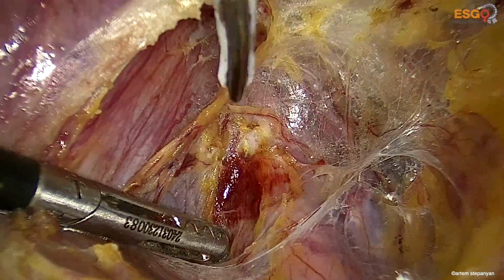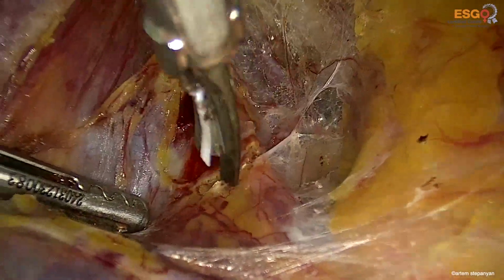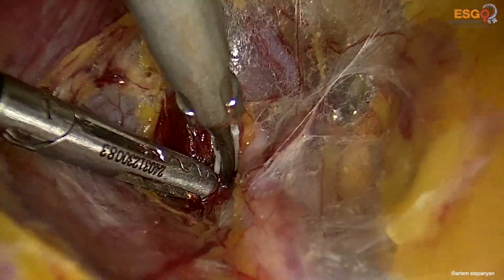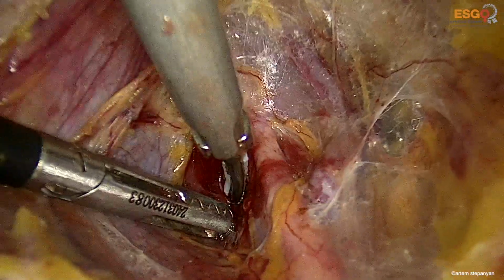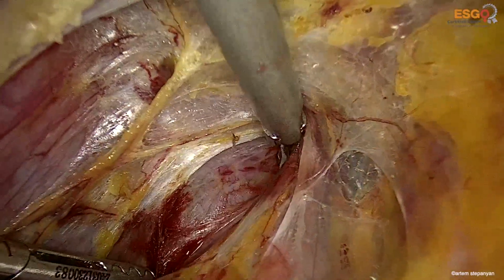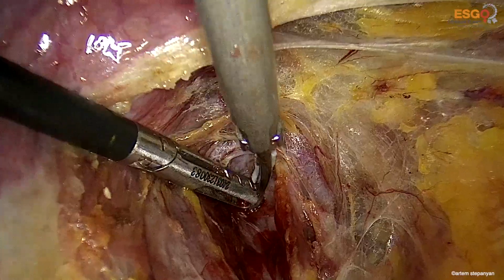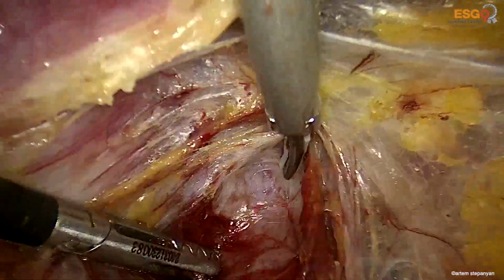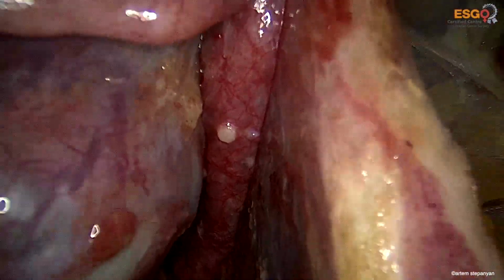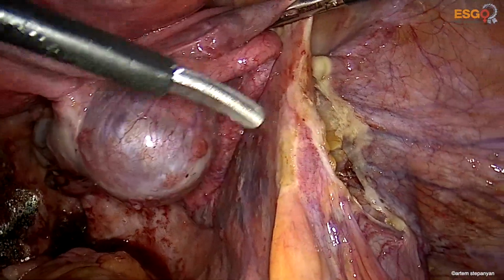Closer to the ureter, we prefer to use the harmonic due to the minimal lateral heat spread from the instrument, and so minimizing the chance of the ureteral injury, thermal injury of the ureter. The Okabayashi space was developed, and on the right side we do the same.